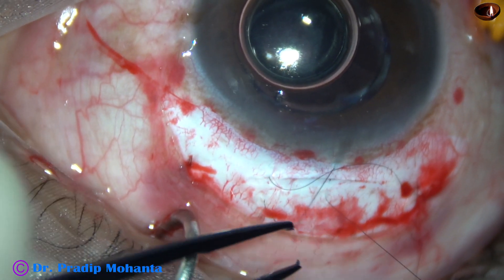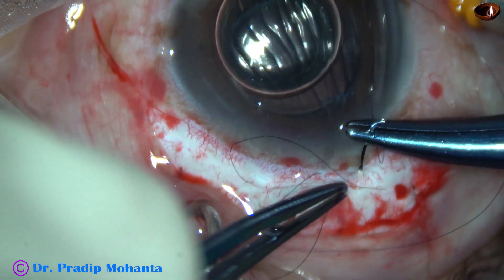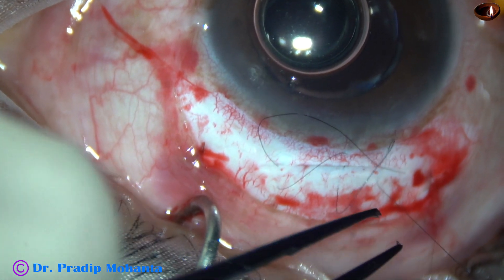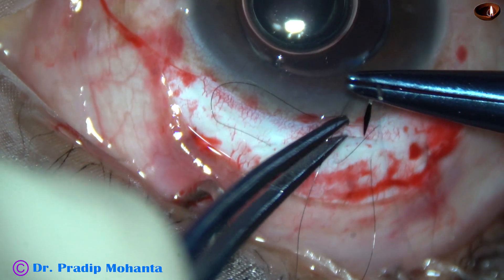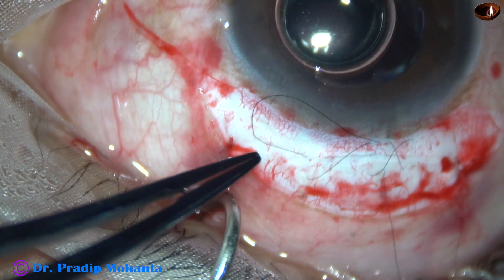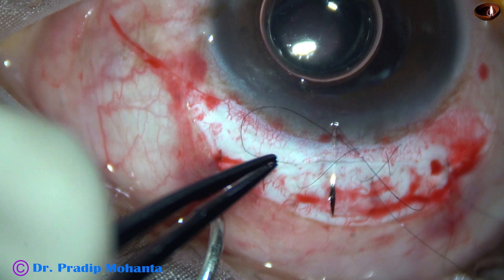The patient is a lady of about 60. She underwent an earlier surgery and subsequently experienced some mild blunt trauma. Since the earlier capsular opening was large, the lens got displaced into the vitreous cavity. Since the anterior capsular rim was nice, this is the best possible way to manage this case.